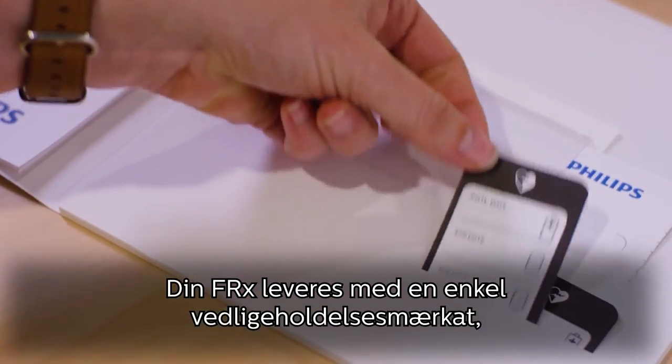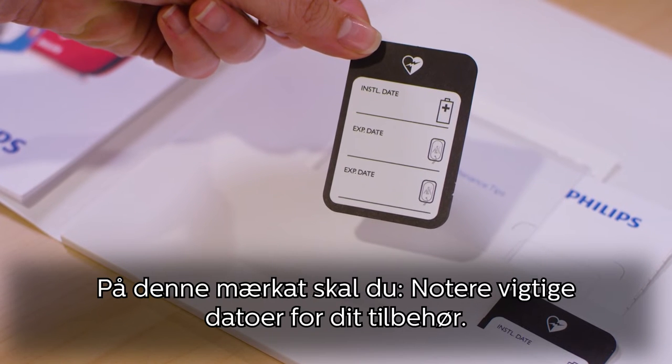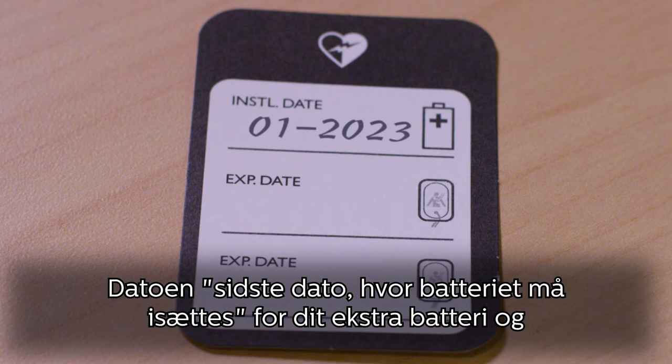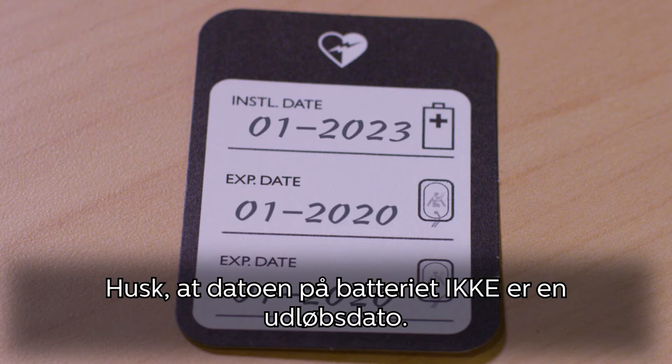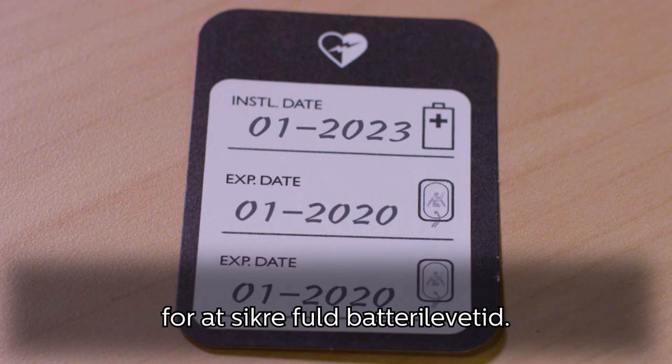Your FRX comes with a simple maintenance sticker to help you keep track of these accessories. On this sticker, write down the key dates for your accessories: the install by date for your spare battery, and the expiration date for your pads. Keep in mind that the date on the battery is not an expiration date — it represents the latest date the battery should be installed into the device in order to ensure full battery life.